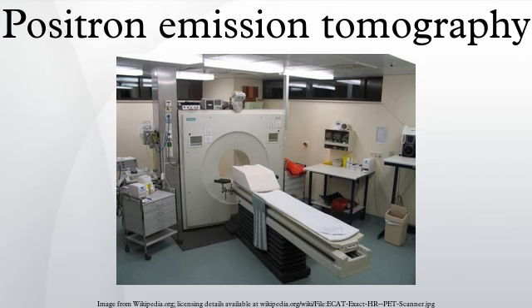Avid Radiopharmaceuticals of Philadelphia has developed a compound called 18F-AV45 that uses the longer-lasting radionuclide fluorine-18 to detect amyloid plaques using PET scans.